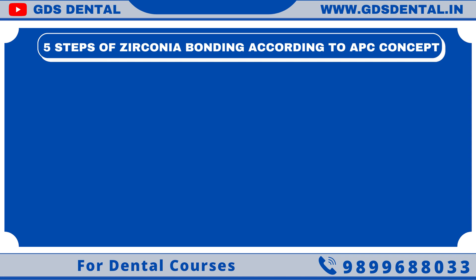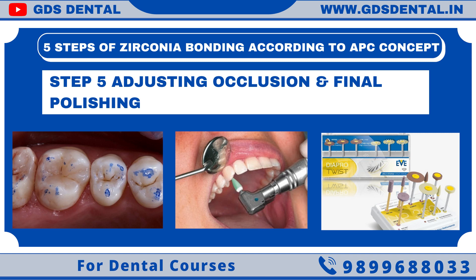Now we are ready for the last step. Step 5: Adjusting occlusion and final polishing. After final occlusion adjustment, zirconia should be polished, as zirconia will not smooth out over time during mastication. Researchers have also found there is more wear of natural teeth if zirconia is left rough, due to its hardness. For this I use Diapol for my final polishing.